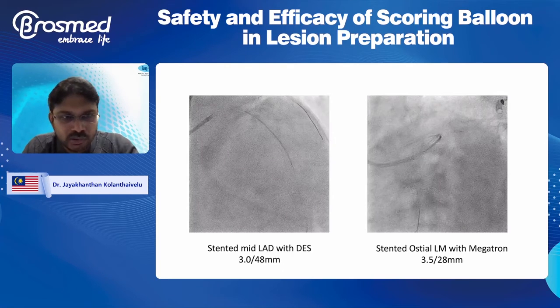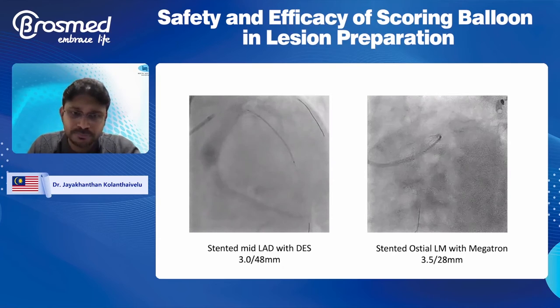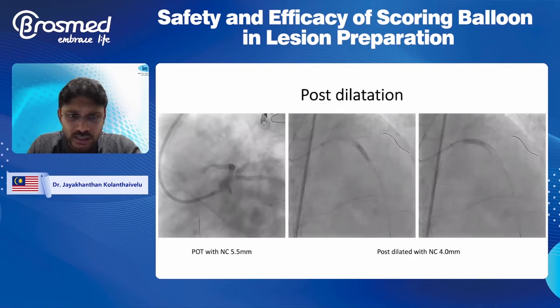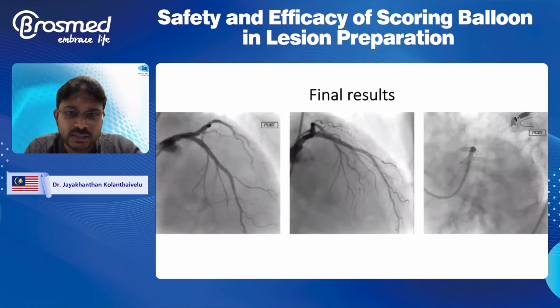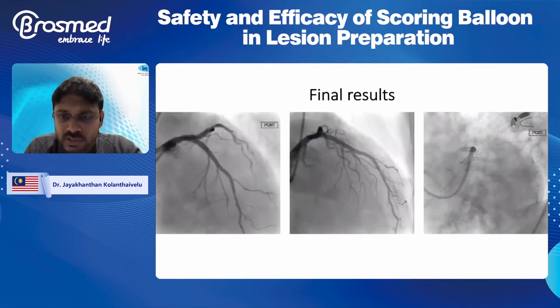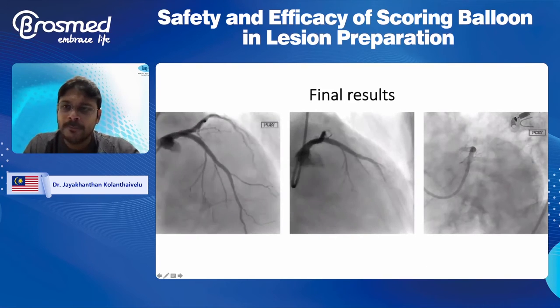Let's not muck around. So we took a 3.0/48 DES, and then we proceeded to the left main with a 3.5/28. The reason why we use the Megatron is because the left main was a 5.5 vessel. So we post-dilated the left main with a 5.5, and then the rest of the system with a 4.0, and this is the final result. We lost the first diagonal there, but it's a very small branch. Otherwise, excellent results.